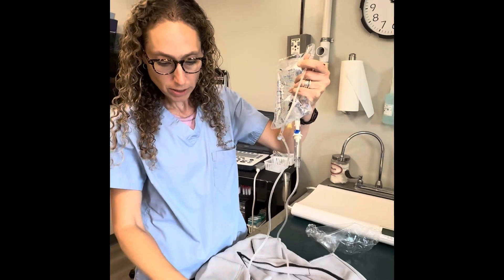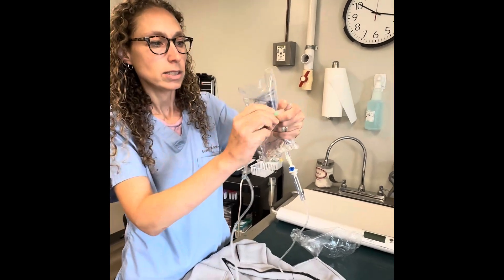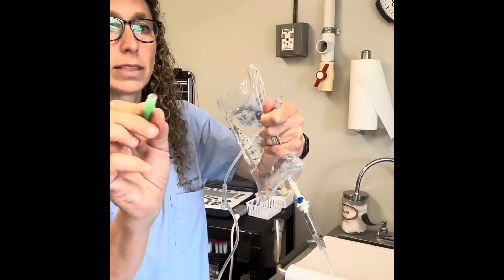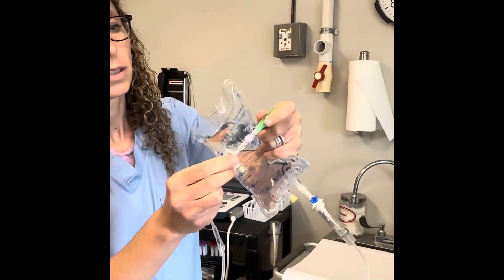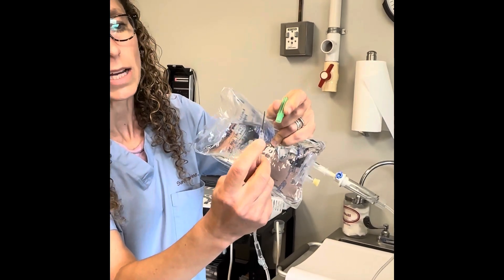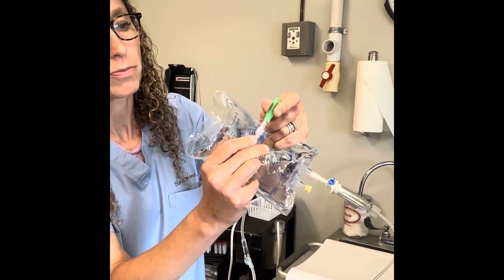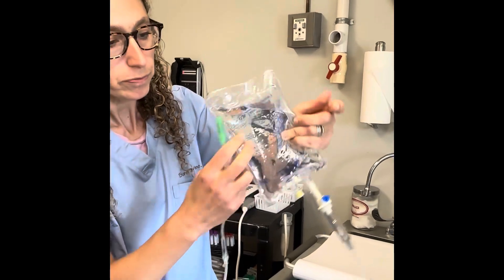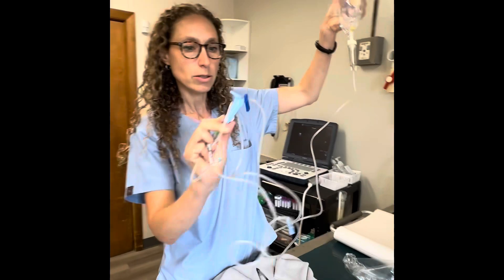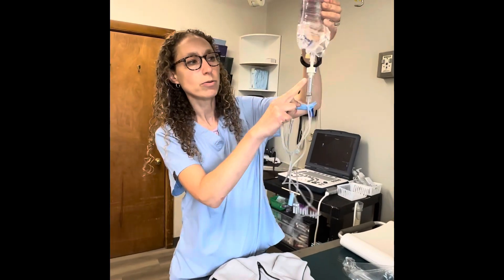Now I'm going to attach a clean, fresh needle. That part's sterile — the inside is sterile. I'll put it on. This is a luer lock, so you twist it to make sure the needle itself can't come off when you pull the cap off. Now this is kinked, the wheel is closed, and no fluid is dripping.